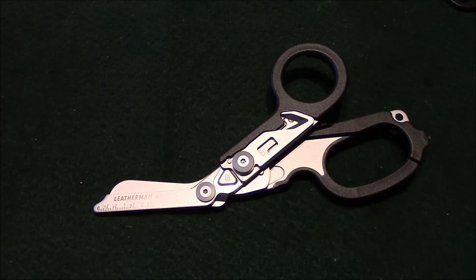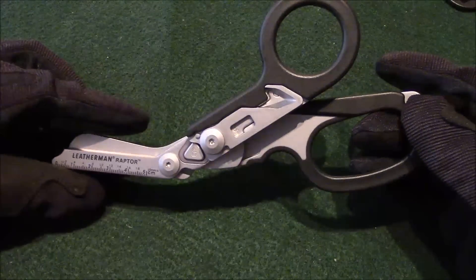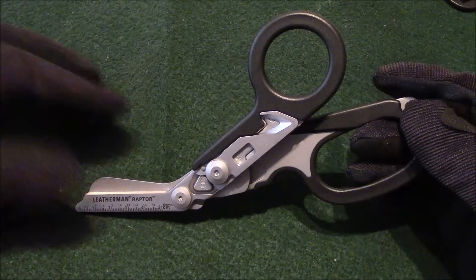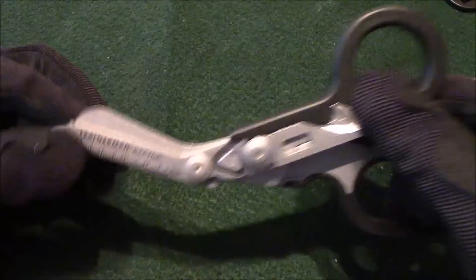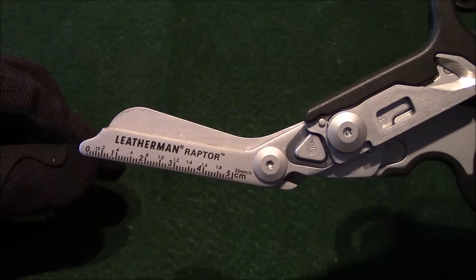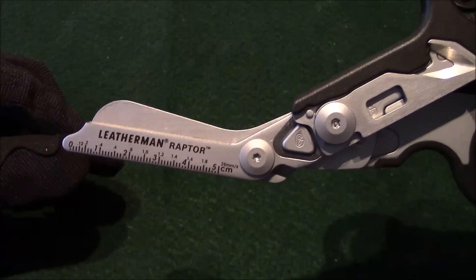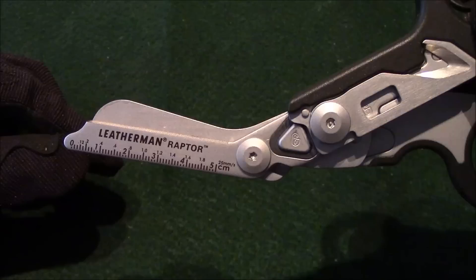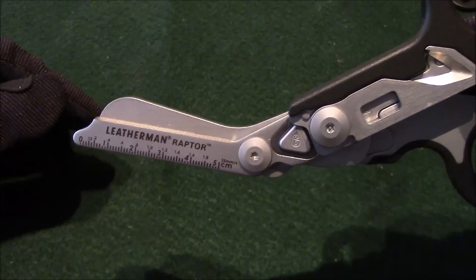Here's the Leatherman Raptor. It's shaped just like EMT shears, or trauma shears. Starting from the front: you can see there are measurements here. At first I thought I'd probably never use that, but some of my friends who are EMT workers have told me it comes in really handy — especially to approximate wound sizes. They can put it right next to a wound and get a pretty good approximation of the size.